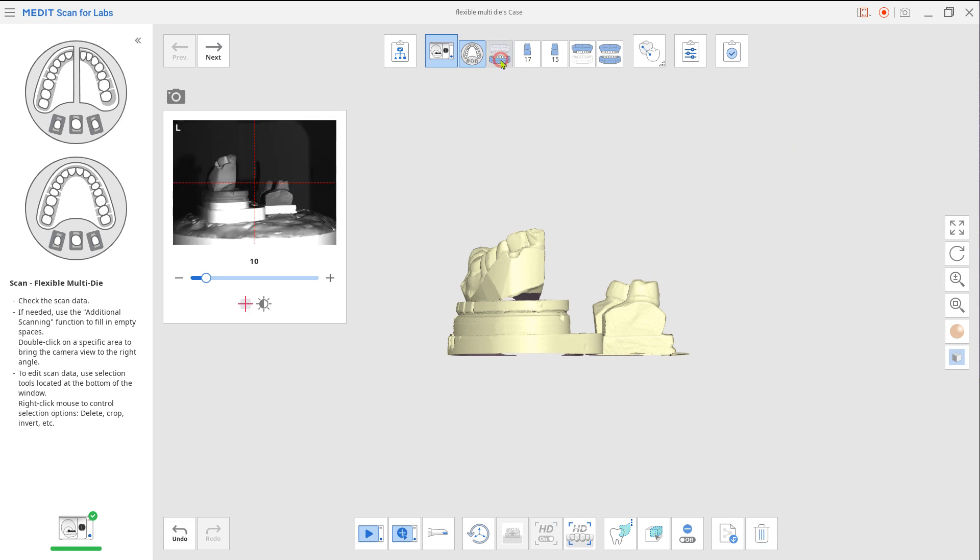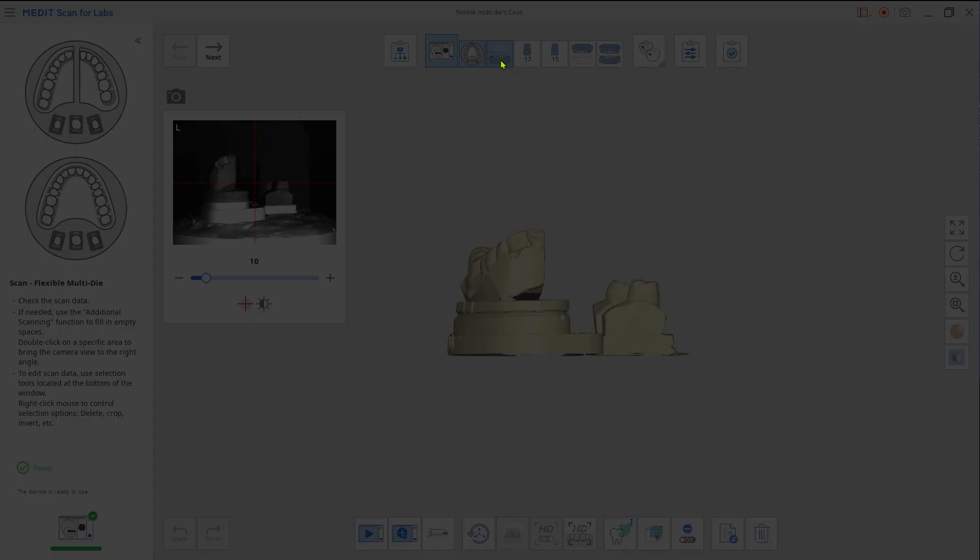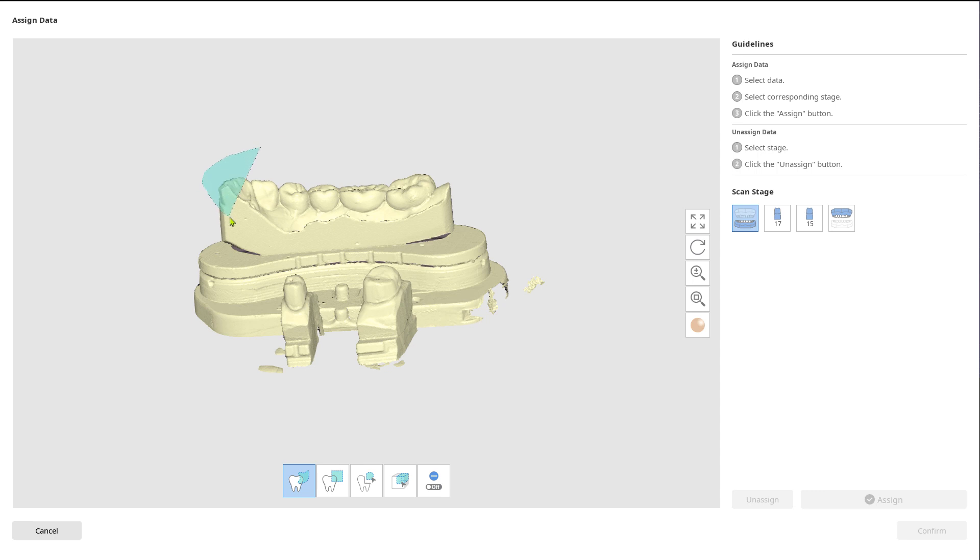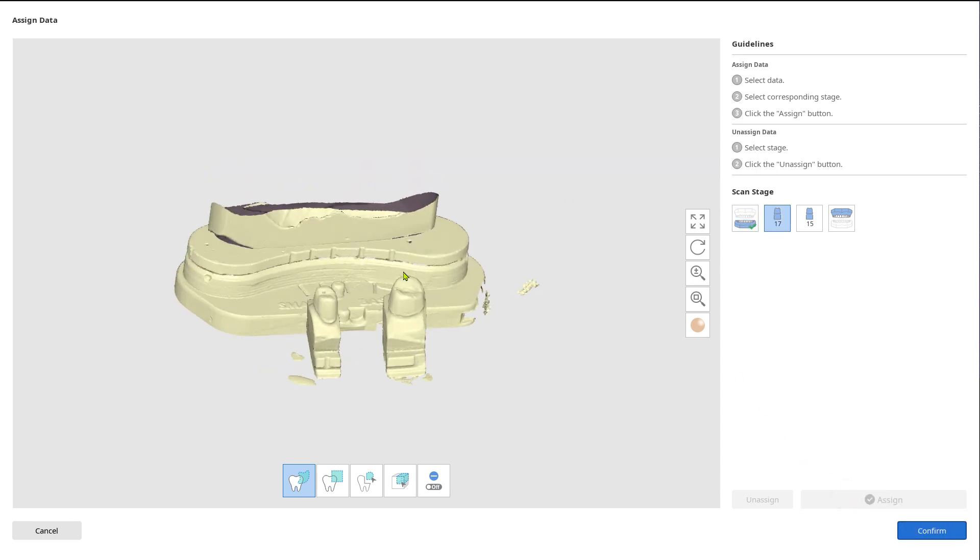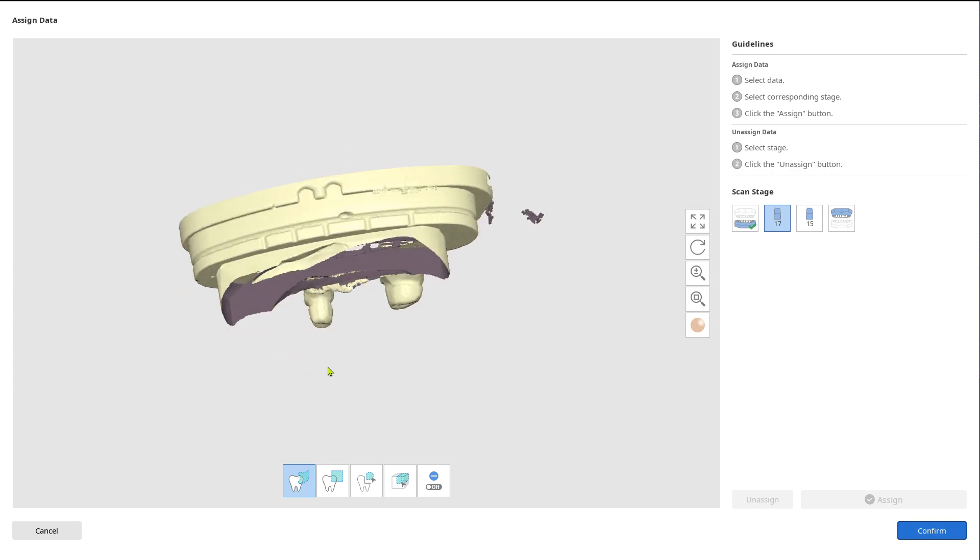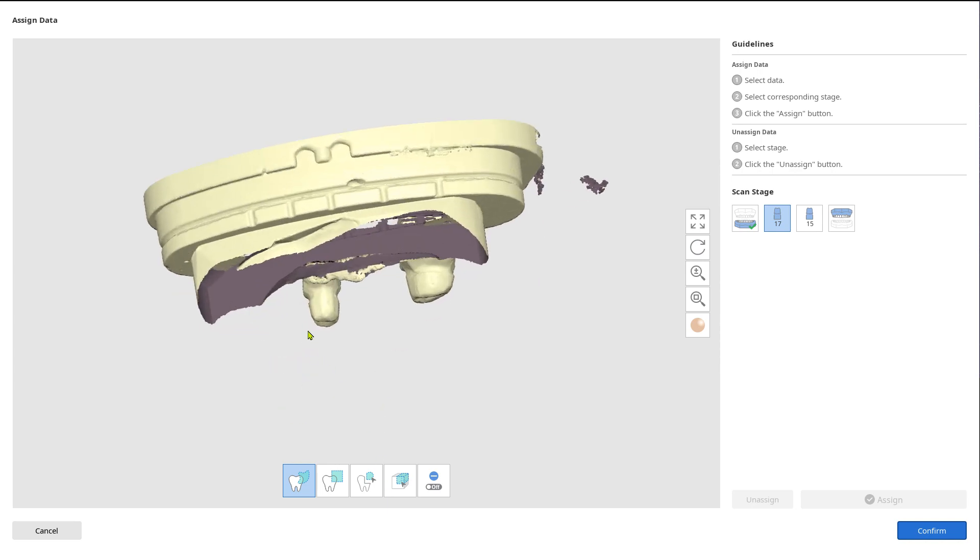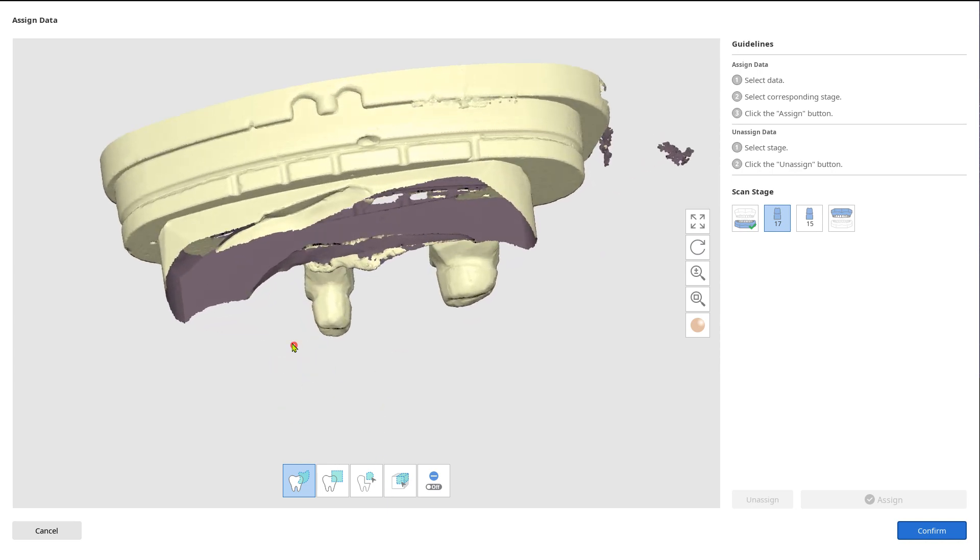Click on the mandible. Now you can select the area which belongs to the mandible. Assign the data to mandibular base from the right scan stage. Do the same thing for the prepped teeth.